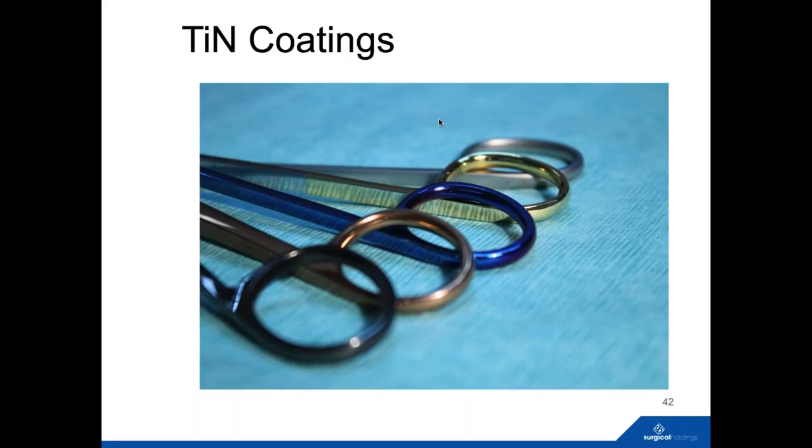Generally speaking, there'll potentially be some sort of titanium nitride coating, but not all will be suitable or robust enough for the washing process. Quite often we've seen attempts at fancy colourings on instruments, and after they've gone through the fairly harsh cycles, they don't last too well.